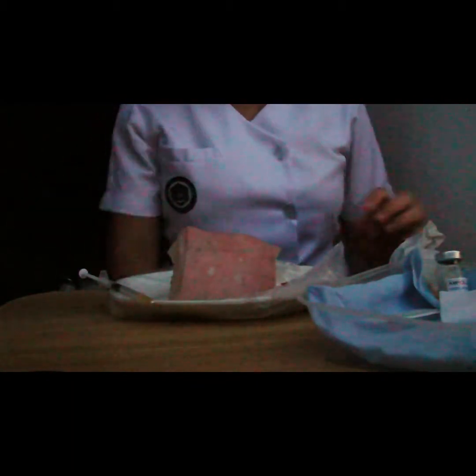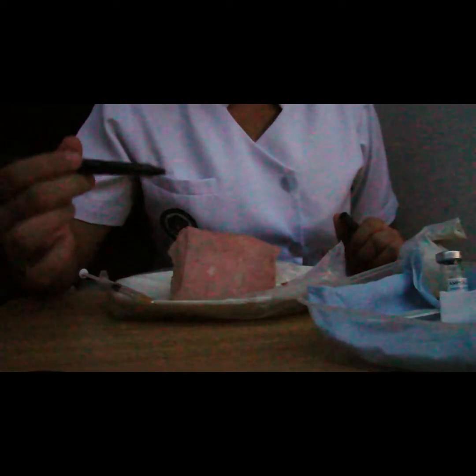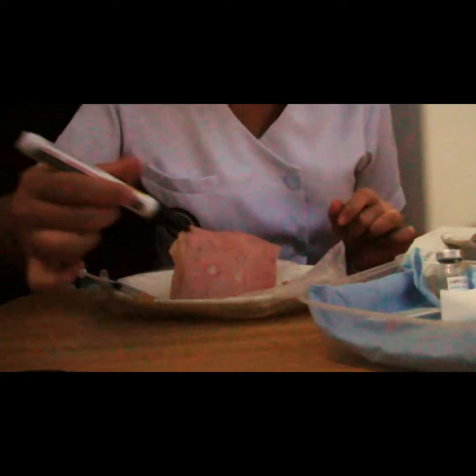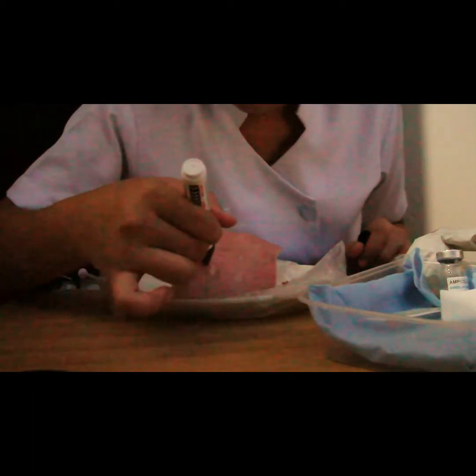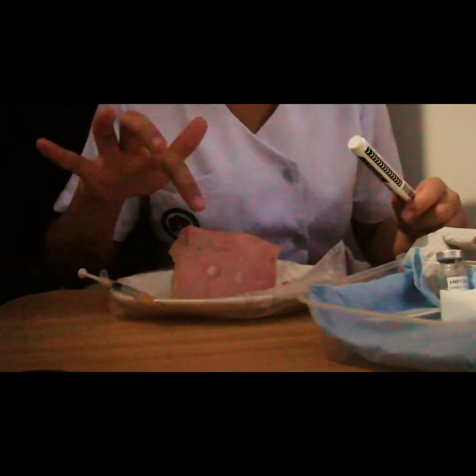And encircle the injection site with blue or black ink to observe for redness or induration per agency protocol. So, since ayaw gumana ng ballpen, basta ko encircle the area, the injection site.